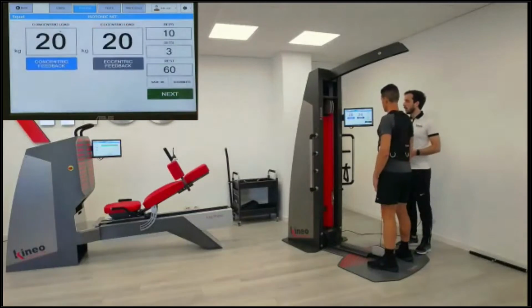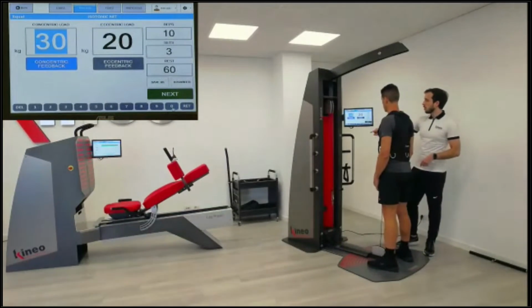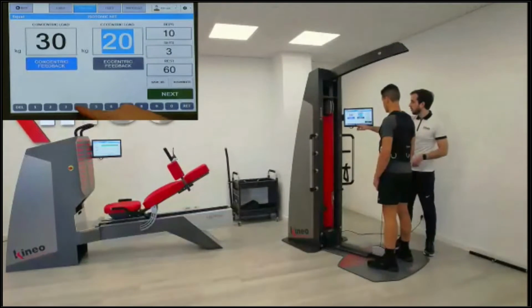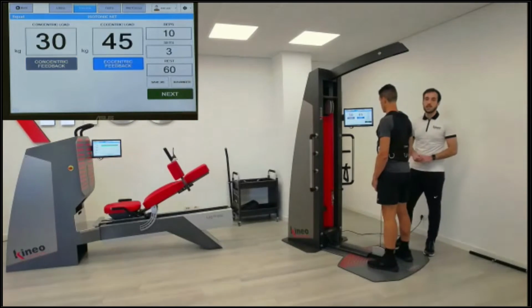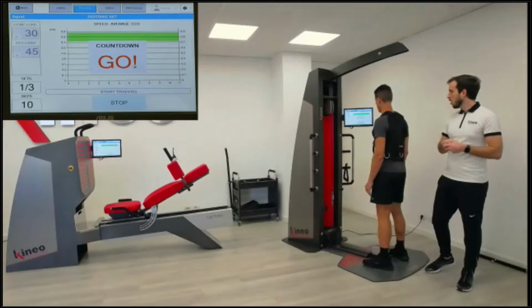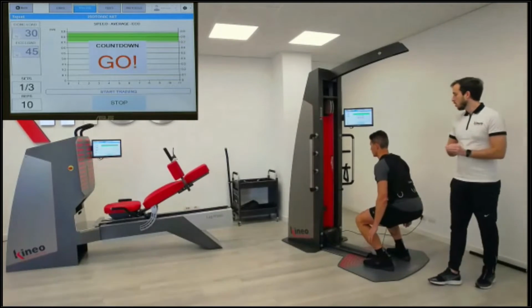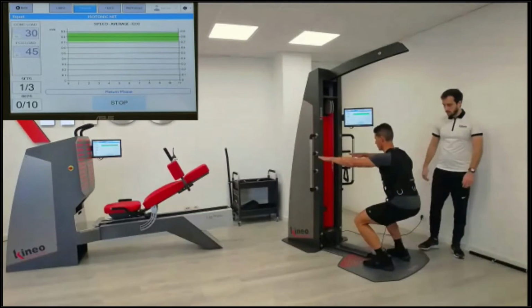So like before, we can do easily 30 kilograms in concentric going up, and let's say 40 or 45 kilograms in eccentric here as well. Next, and start. Please, Damiano. Center. Okay, so please go. All right, keep your, all right, good, thank you.